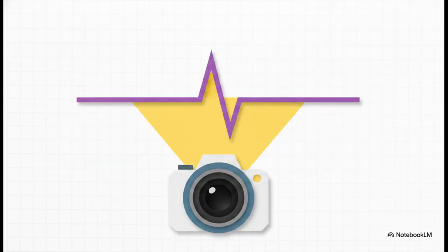And finally, the biphasic deflection. You get this when the mean orientation of the depolarization vector moves at a right angle to the lead axis. So the spotlight isn't running at you or away from you, it's running straight past you, crossing your field of vision from left to right. As it gets closer to your peripheral vision, it registers as slightly positive. But the second it passes you and starts moving away, it flips to negative. The machine literally draws a wave that spikes up and then immediately dives down.